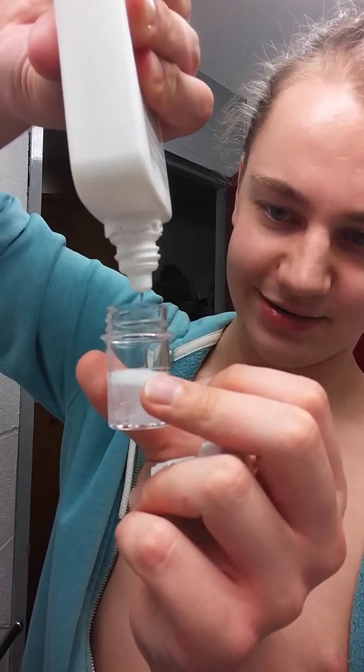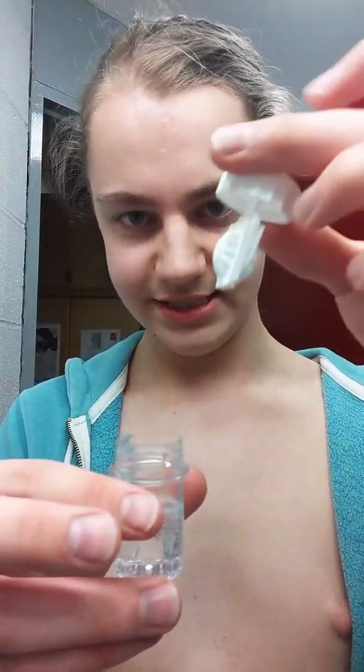Repeat steps two through four for the other eye. Then fill your contact lens container up to the line. Then put your lenses into the water and shake. That's step five slash something — I can't remember how to count. Step 19. Put your glasses on and turn the light off. And maybe put on some clothes if you're me.